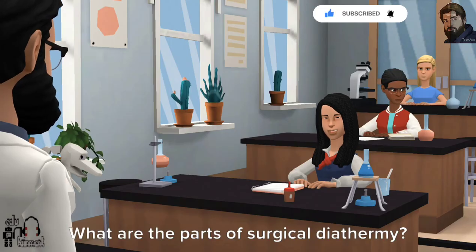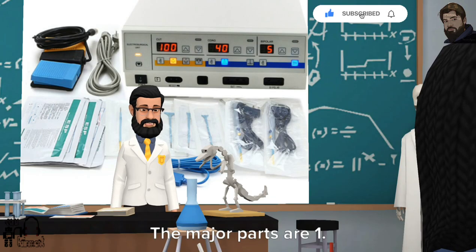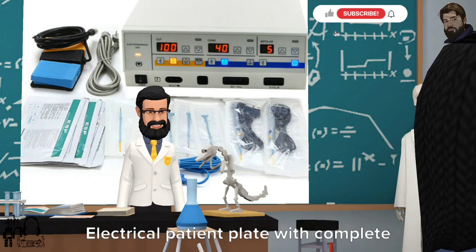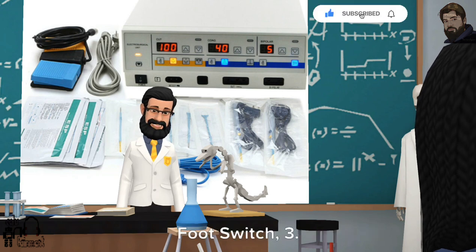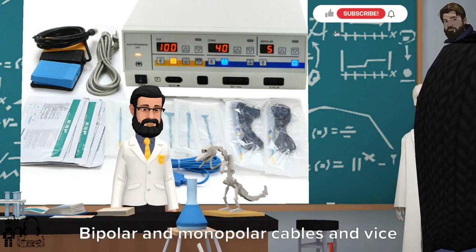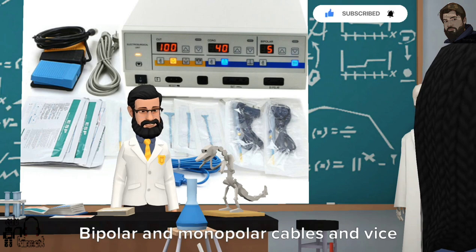What are the parts of surgical diathermy? The major parts are: 1. Electrical patient plate with complete set, 2. Foot switch, 3. Bipolar and monopolar cables.